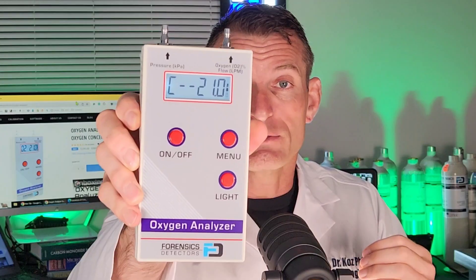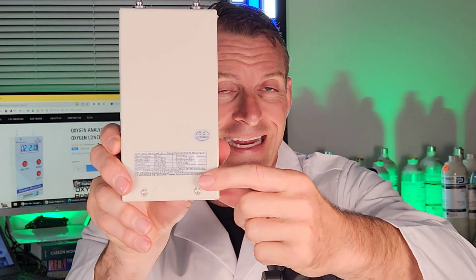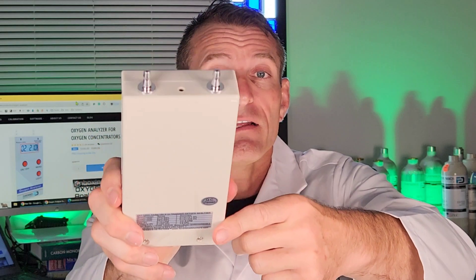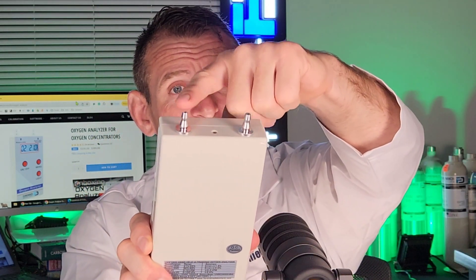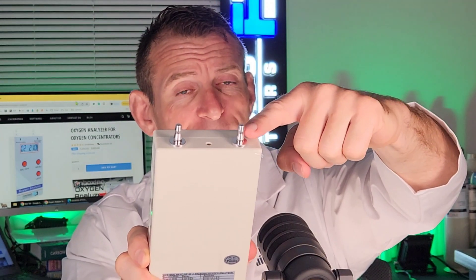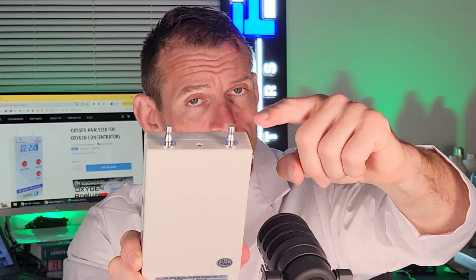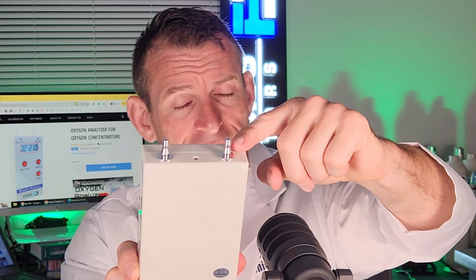That's what it looks like at the front, that's the side profile, that's the back profile, and you have your product tag with specifications. At the top we have two quarter-inch barbs — the first barb is for oxygen concentration and flow, and the other barb is for pressure. So if you want to measure pressure, you put the tubing on the pressure barb.